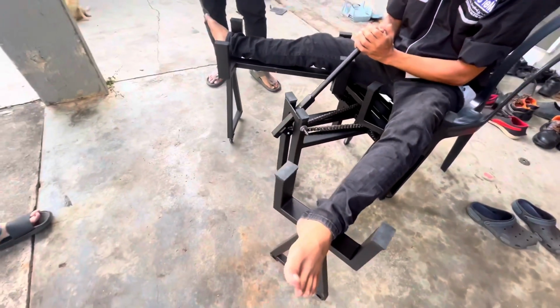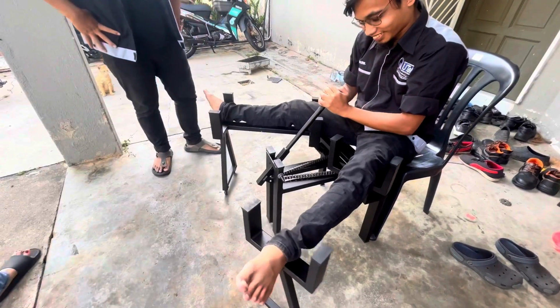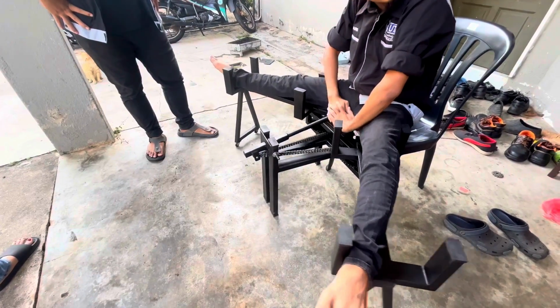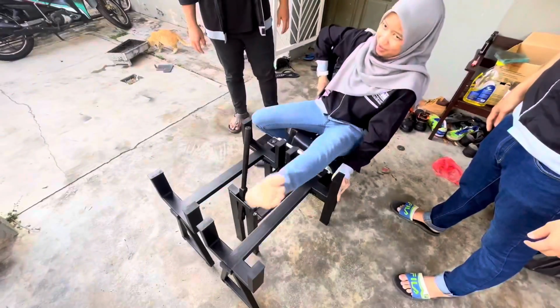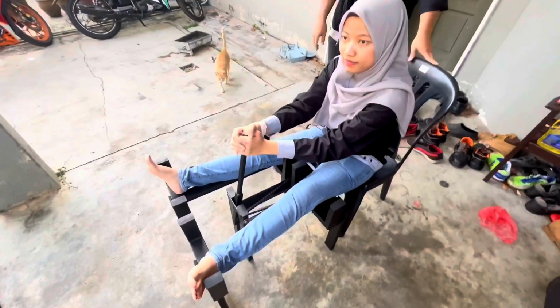Firstly, the patient needs to grip the handle and pull it to move the sprocket and chain. It makes the leg stretcher expand and therefore it can stretch the leg. The damper, which is white in color, is used to control vibrations by dissipating the excess energy and controlling the motion. Okay, now let's see how the female patient uses the assisting device by herself.